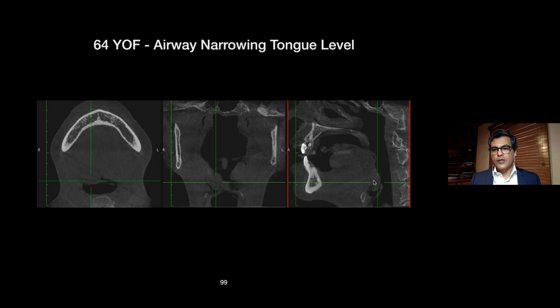So especially in older patients, when we see these kinds of polypoid thickenings in the lingual tonsil, it is always advisable to either look at the tonsils themselves, using a tongue depressor, and examine them clinically, or send them to their physician or ENT specialist, because this area can also develop certain types of cancers and they can manifest similarly. So it is always wise, if you see this, to at least examine clinically how they look.